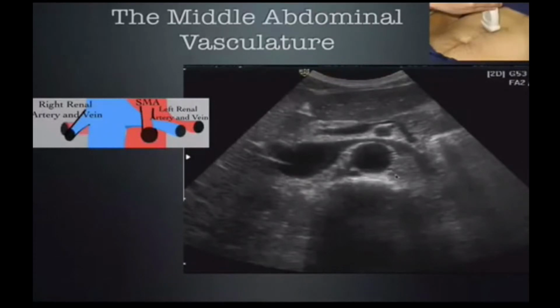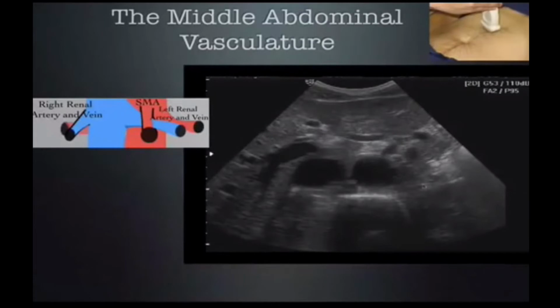And it's important for me to make the point that, generally speaking, the renal arteries are not going to be visualized with abdominal sonography. Your key landmark for the renal arteries is going to be the superior mesenteric artery, which takes off of the aorta almost immediately before the renal arteries when going cephalad to caudal. Now let's take a video again to get oriented.